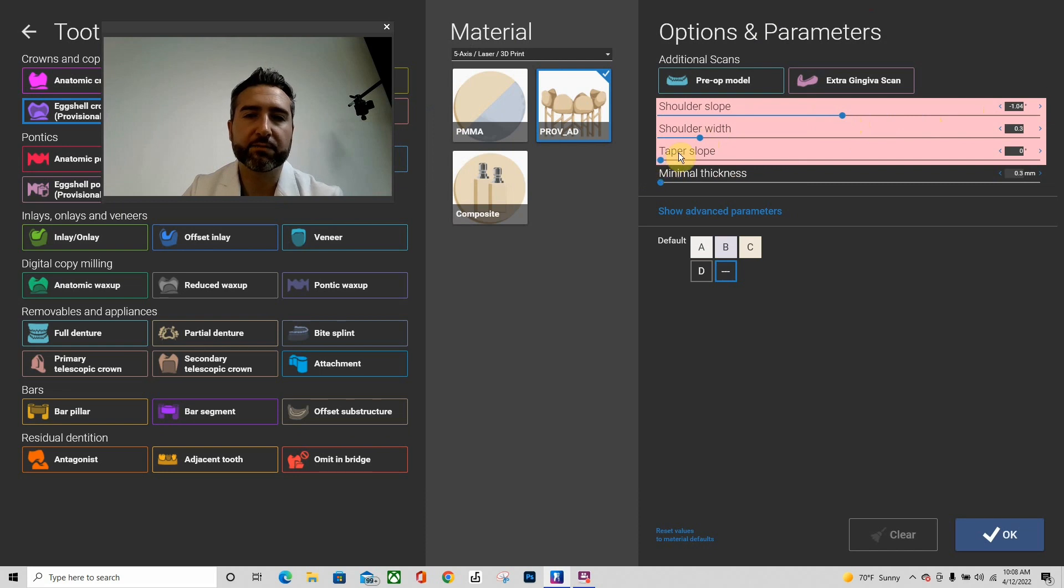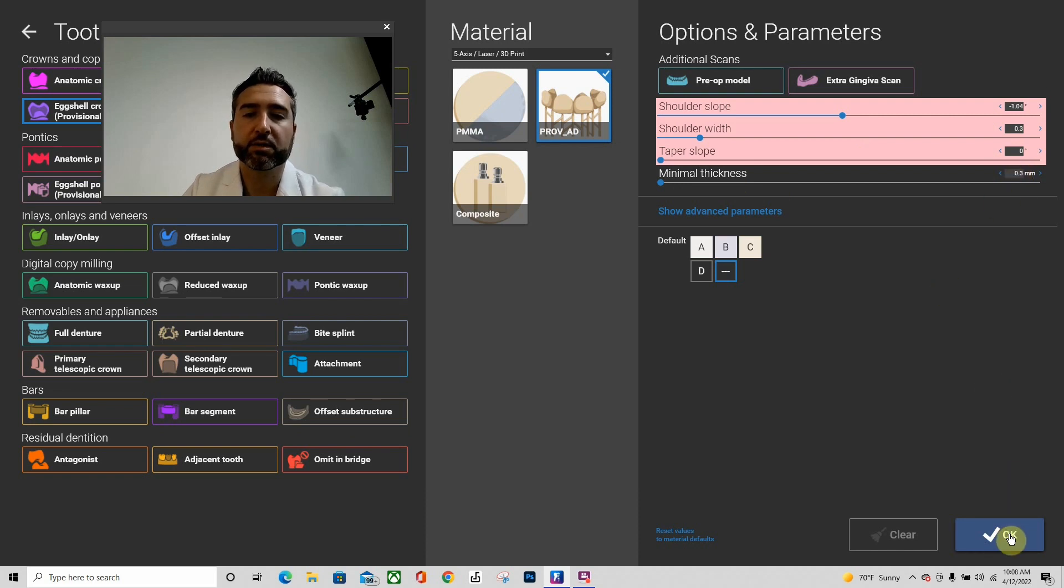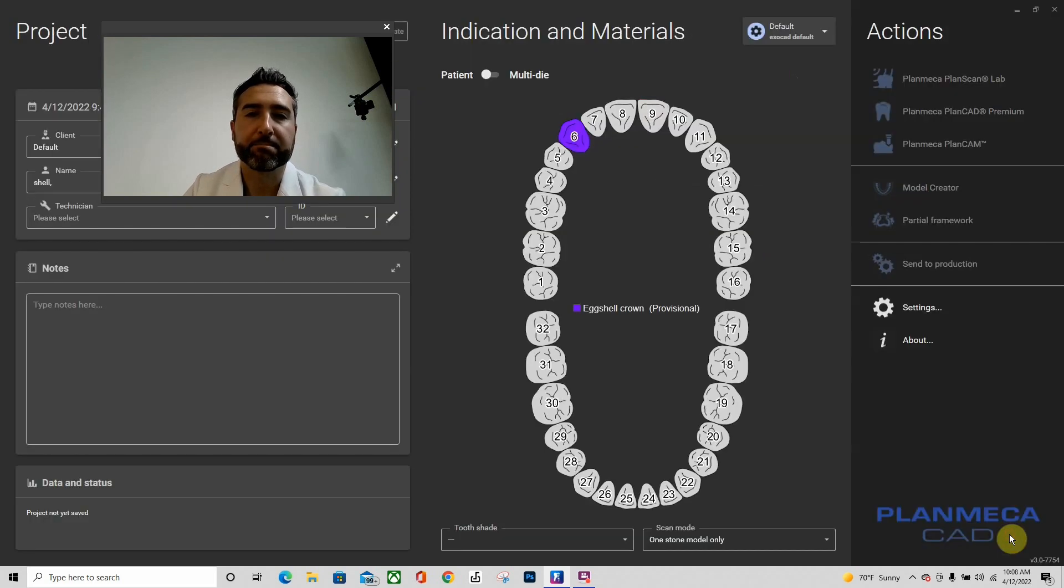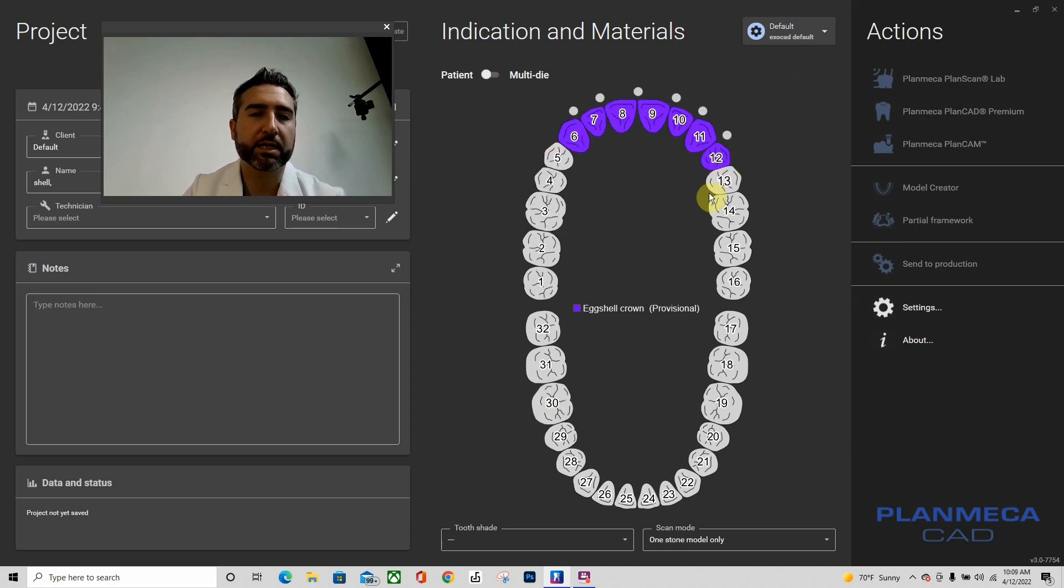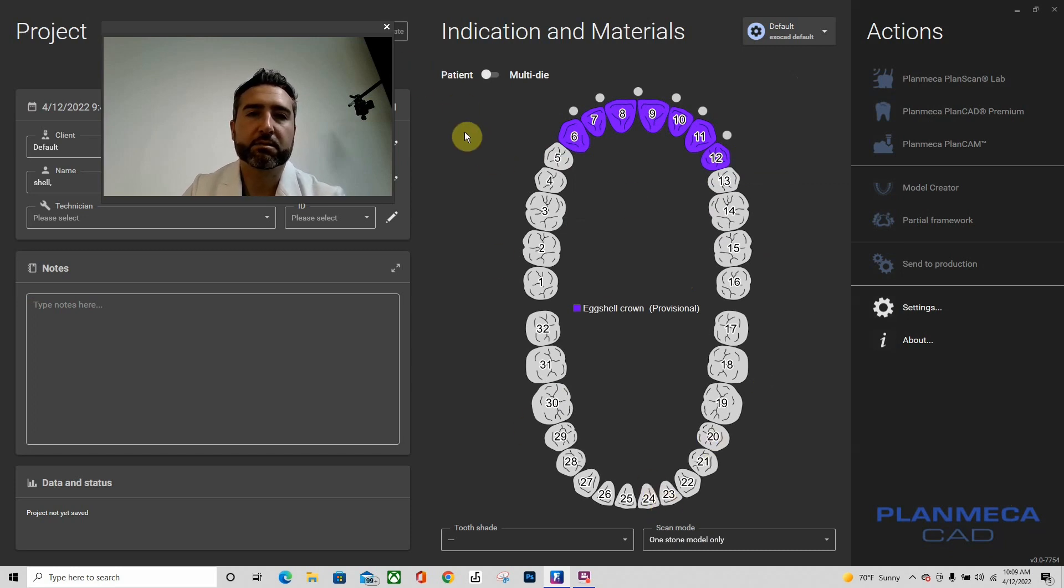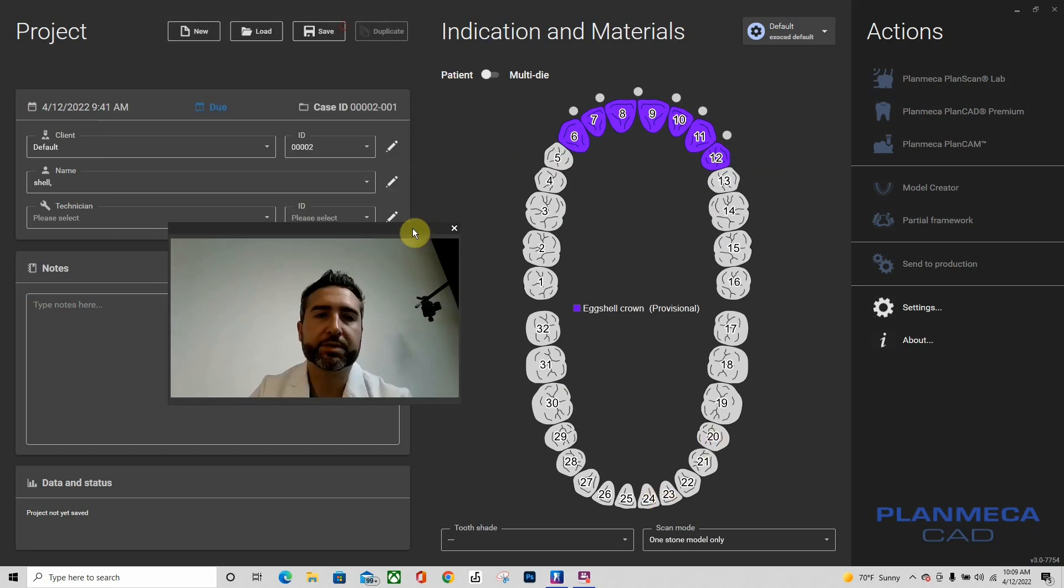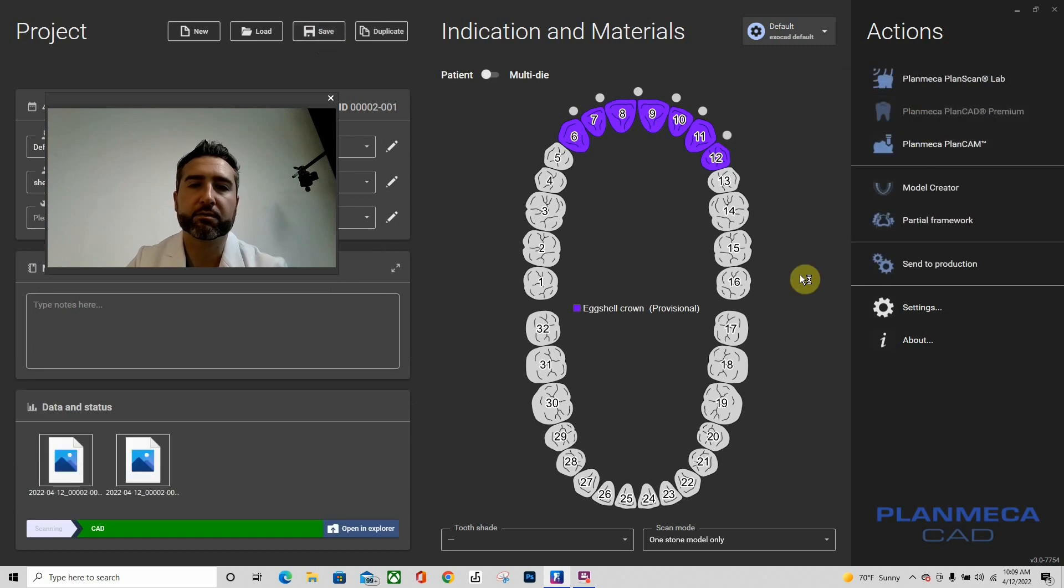Let's go ahead and shift-click that all the way to tooth number 12. I'm not going to do connectors, and that's it. No opposing, no antagonist. We're going to go ahead and save and go straight to design.